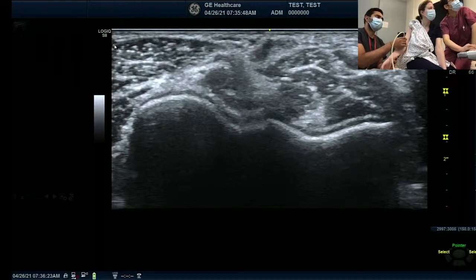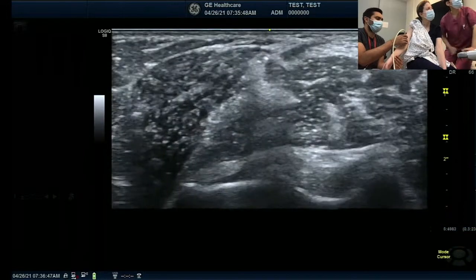And this whole thing is brachioradialis. And then radial nerve. But in this one, you can see the fascia line. Actually, radial nerve is going into the brachialis here. You can see it. This is the extensor carpi radialis longus and brevis. You can see the fascia line, this one, and EDC starts from here. Okay, we're gonna move.